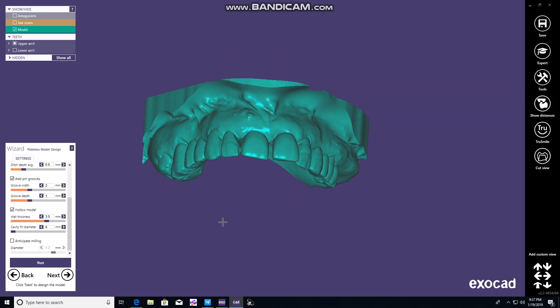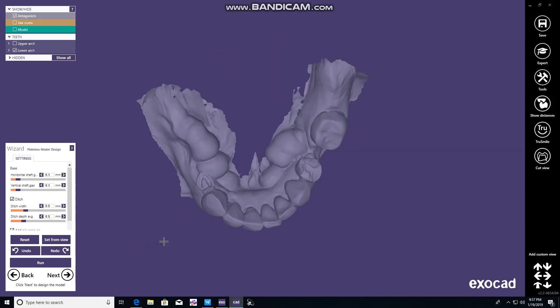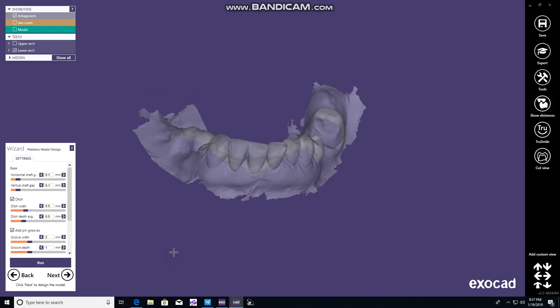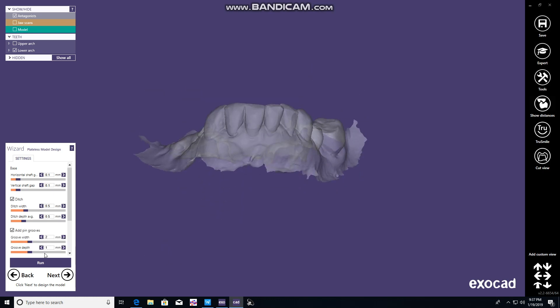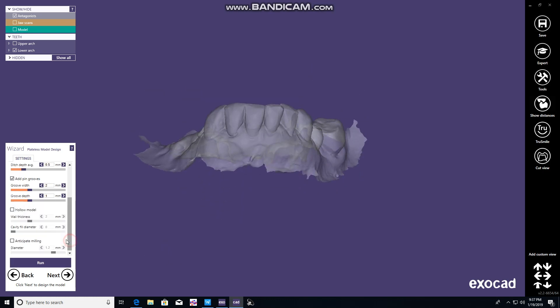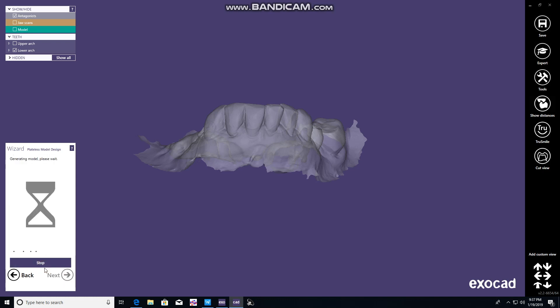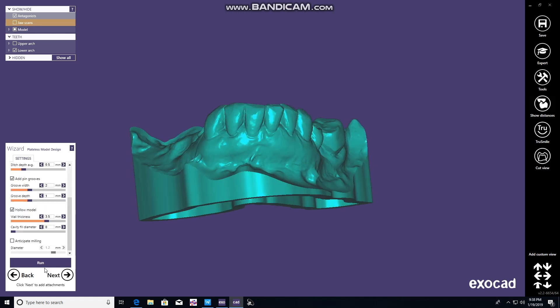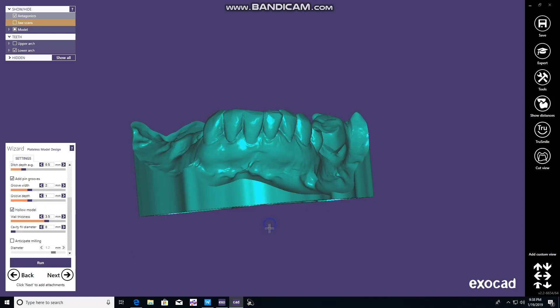We'll hit next and do the mandible. Same thing - go down and set your parameters to hollow the model. In our office, we choose 3.5mm thickness, sometimes 4mm. Run it. Again, it thinks. It'll get to it here pretty soon. There you go. There's your model.